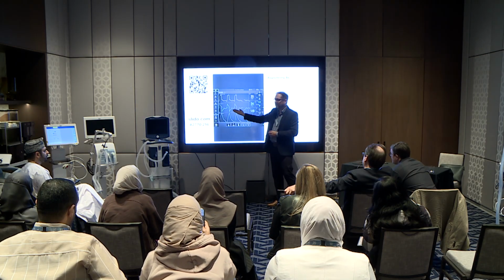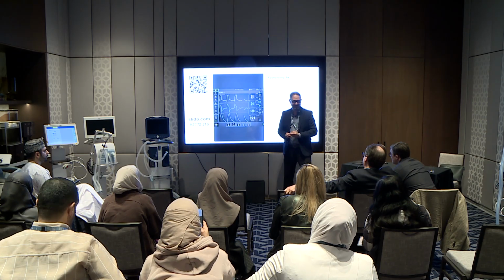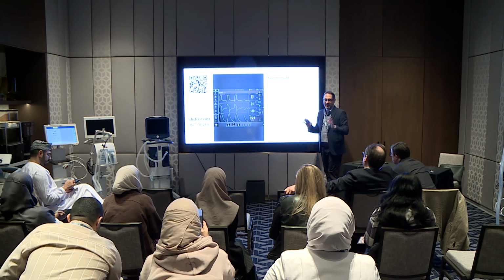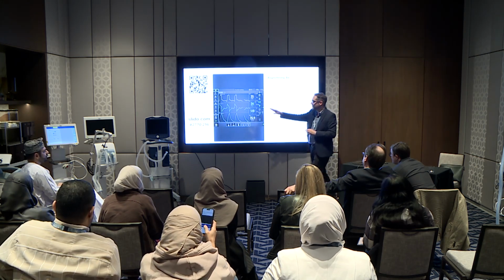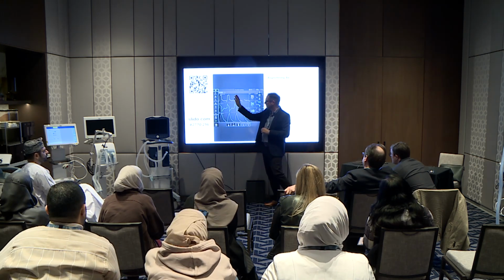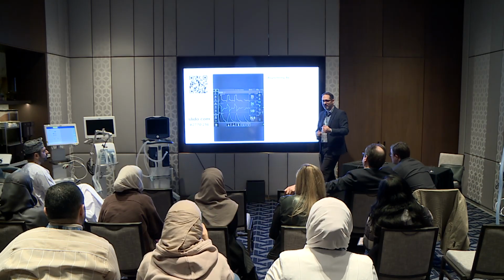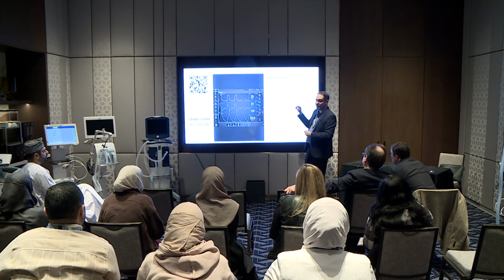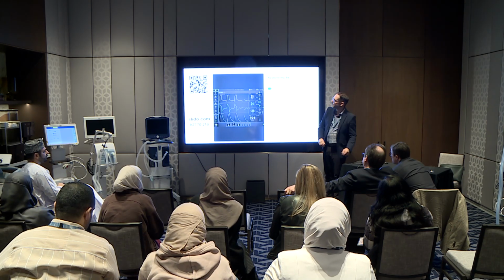They're not really pulling it in, so I wouldn't say it's under assisting maybe, because they seem to be getting enough assistance. There's no evidence that they're pulling in more than what I'm giving them during inspiration. And now we're gonna go and look at the expiratory phase. That's where the hint is, as to, again, not what the type of asynchrony is, but in which category this falls under. Let's see how we did.